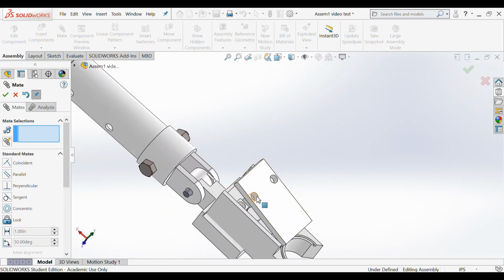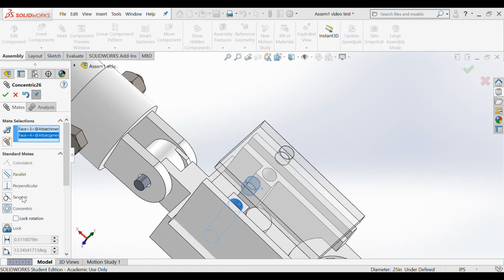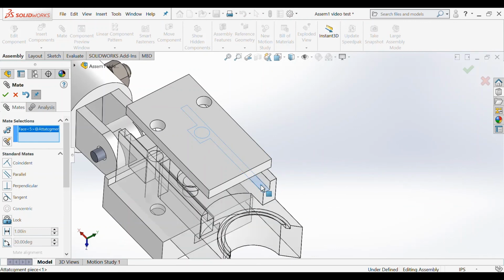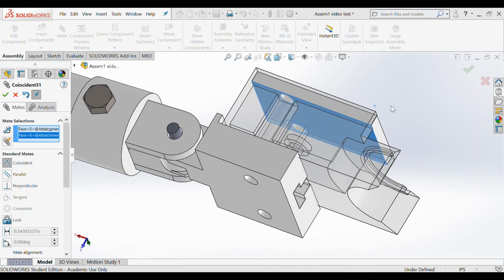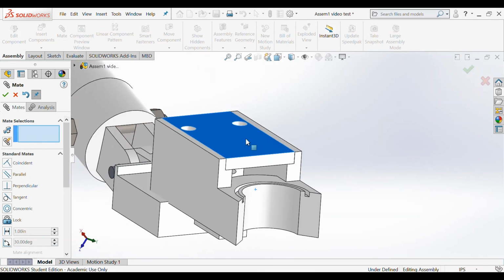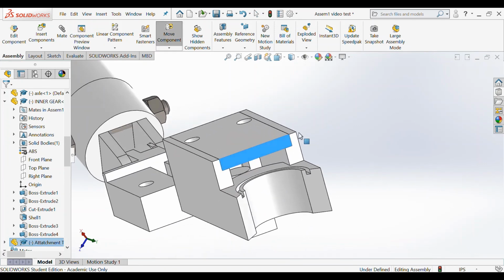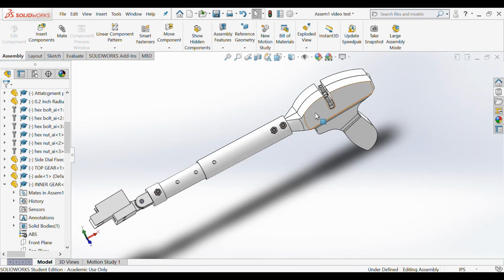Next, I'm going to make the inner hole of the attachment piece top concentric to the hole on the attachment piece. Now I'm going to make the face, this face highlighted right here, coincident to the attachment piece top. As you can see, the attachment piece is connected to the attachment piece top. And now we have fully assembled our device.